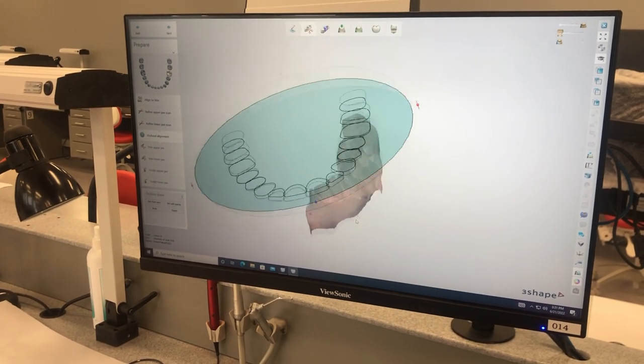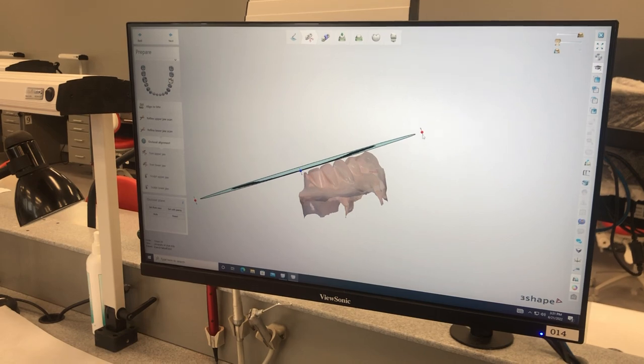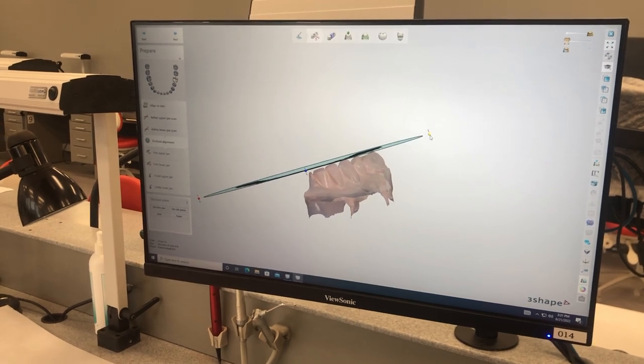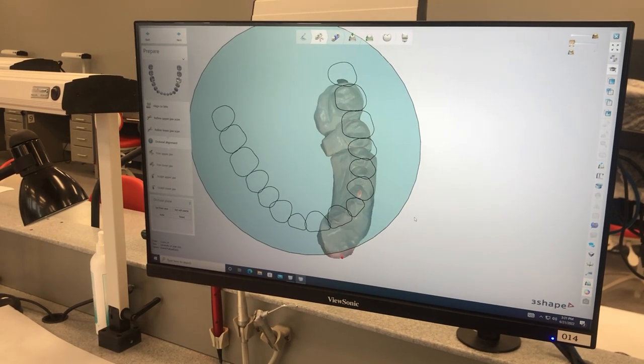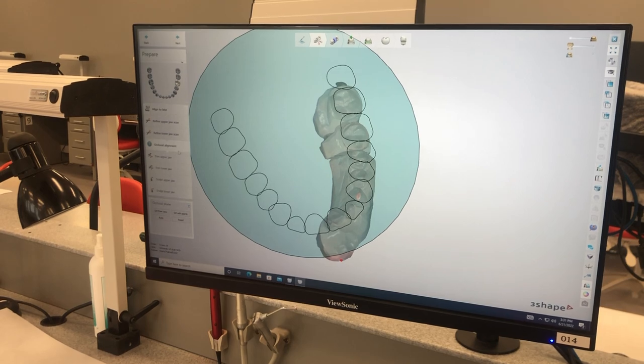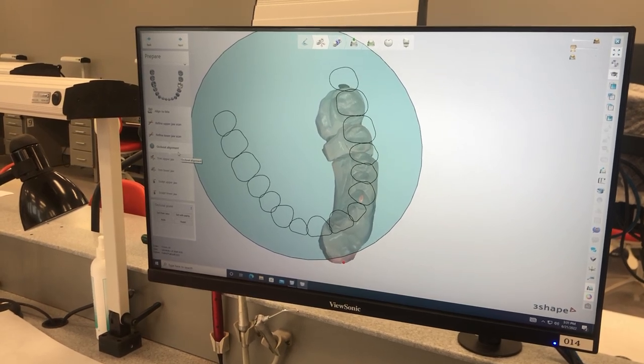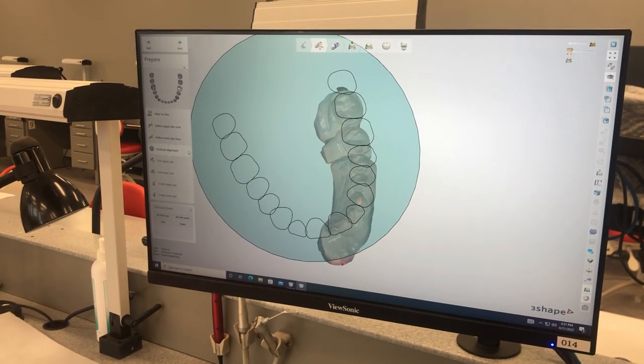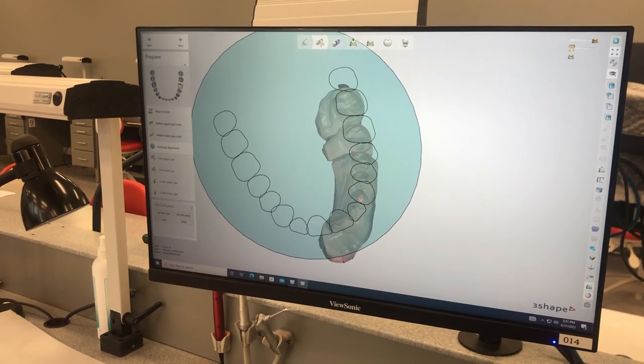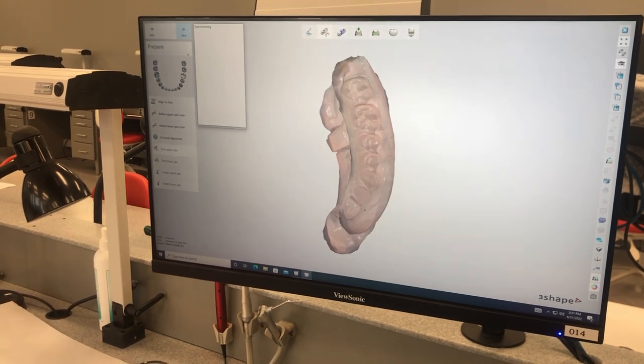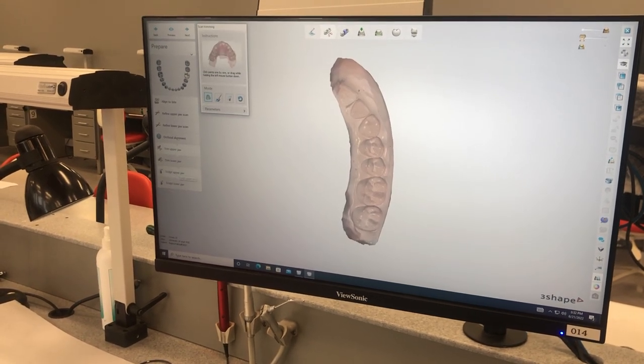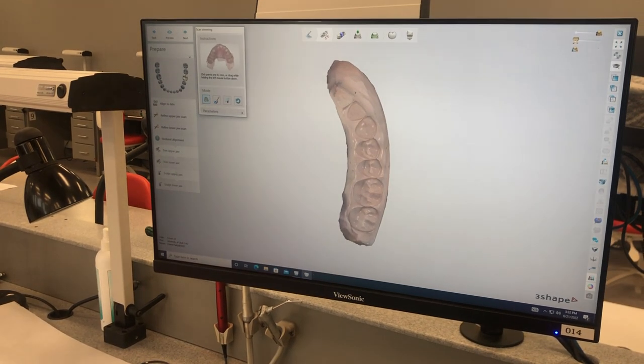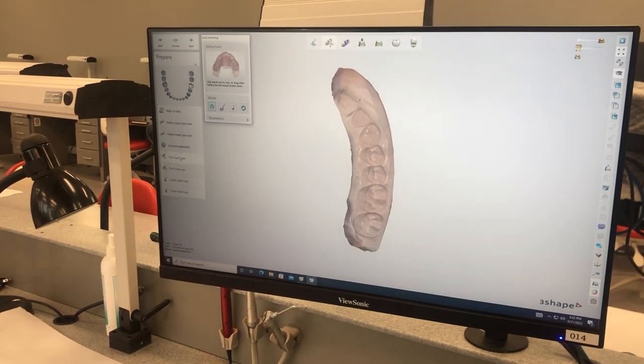Now we go to occlusal alignment. You want to make sure this is good. This one actually came in pretty nice, and this is just the alignment of the arch. And then go through the design as they did previously.